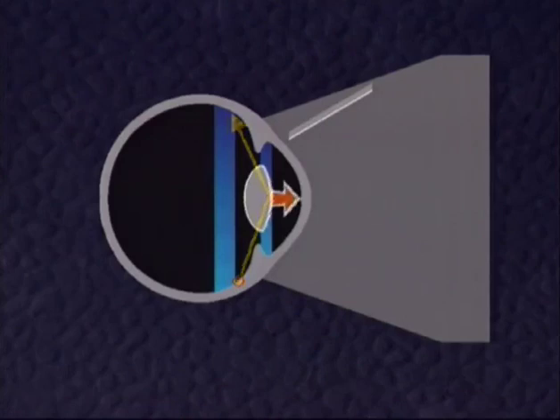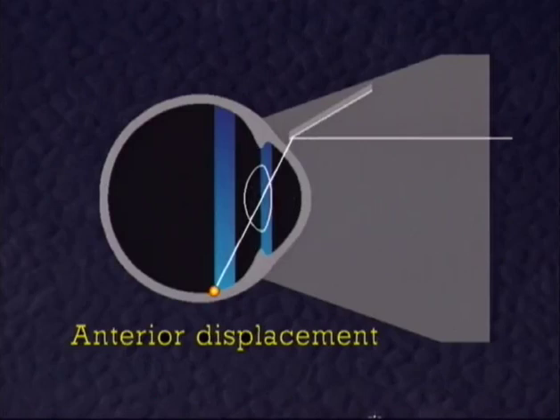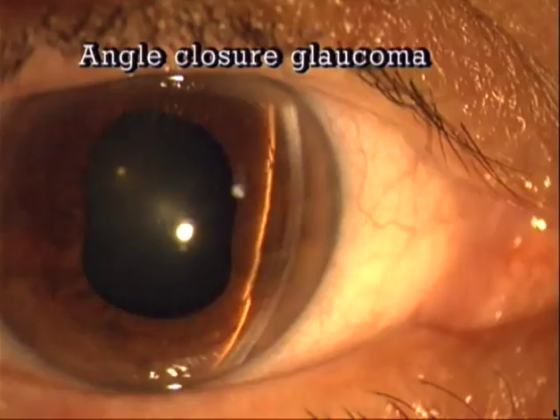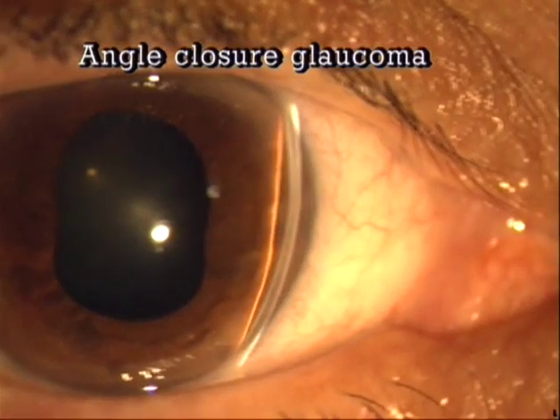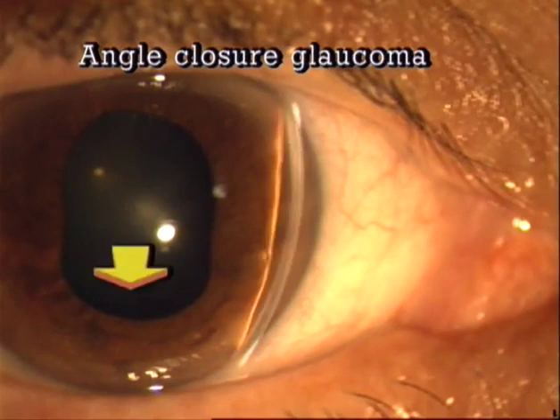On the other hand, the outermost periphery becomes visible if the lens has been anteriorly displaced. Then the optical conditions for visualization of the equator become valid for more anterior parts as well, and so rays from the outermost periphery can pass through the anterior surface of the lens. For example, in this case of angle closure glaucoma, with a flat anterior chamber, the lens has moved anteriorly and blocks the chamber angles.